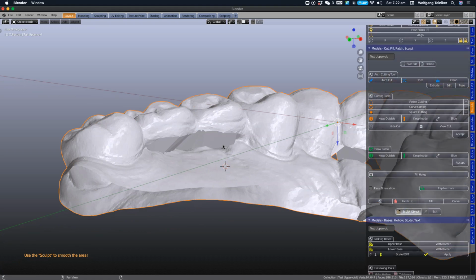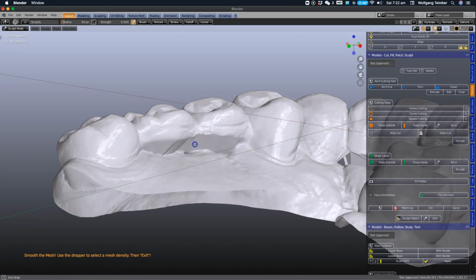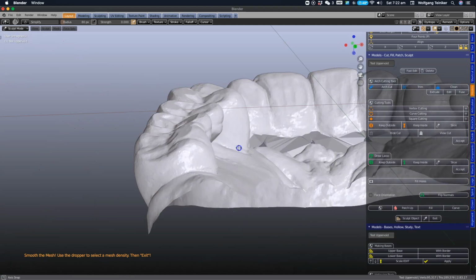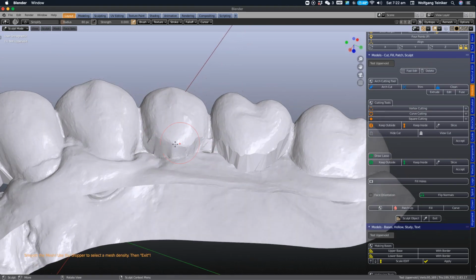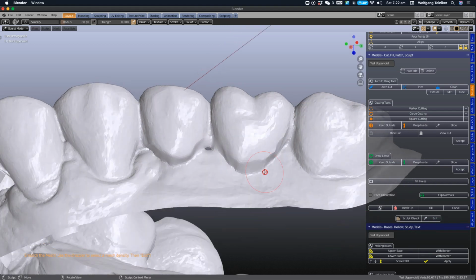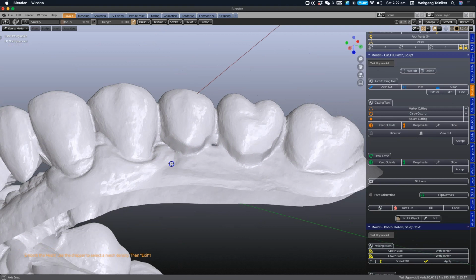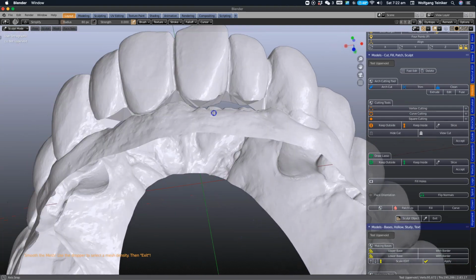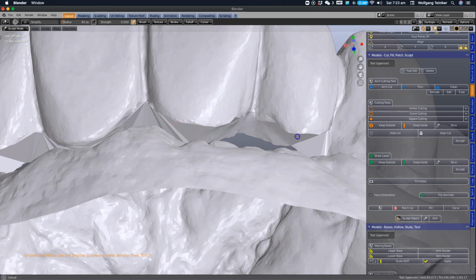From here we're just going to smooth down the area. So into sculpt. And we're just going to brush over. Make sure the mesh is nice and clean. Like that. So we can see we've got a small interproximal opening, so it's not a hole in the mesh as such, which we will close in a minute. Here we can just smooth a bit the underside like that, very easy.